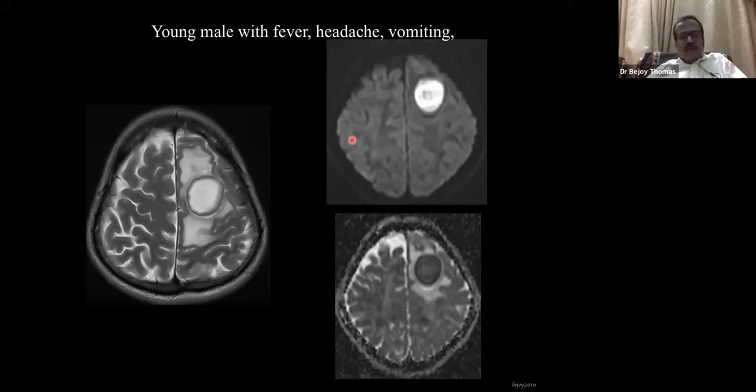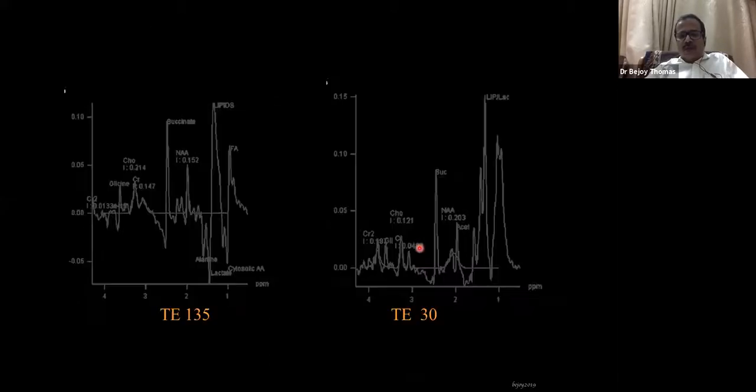If you see this well diffusion-restricted lesion, with a central diffusion restriction and peripheral vasogenic edema, you are pretty much sure that it's an abscess. Although in India, a tubercular abscess can also be like this, or even liquefied caseating tuberculomas. But in the acute presentation, we know that this is an abscess. So you need only a diffusion to do that.